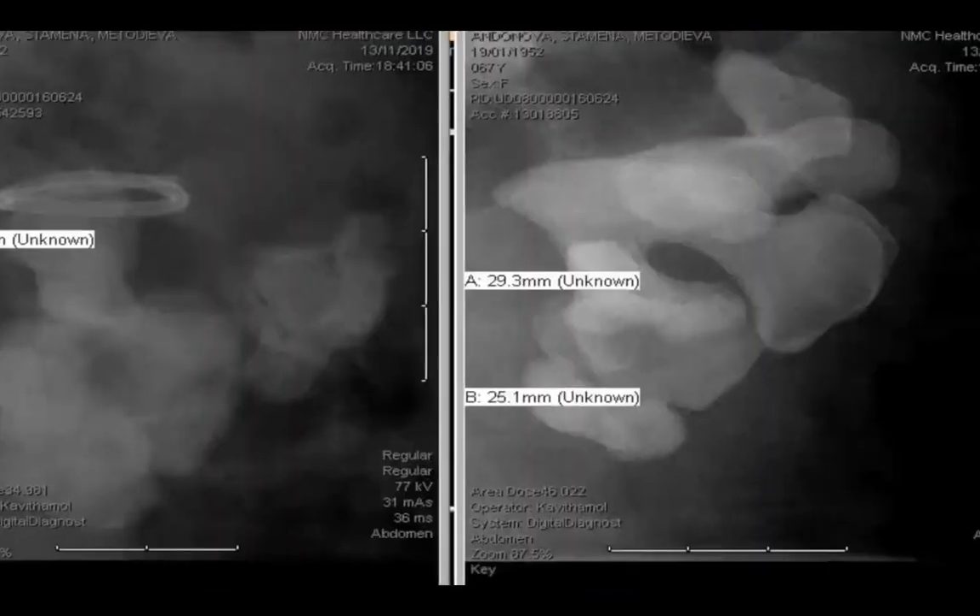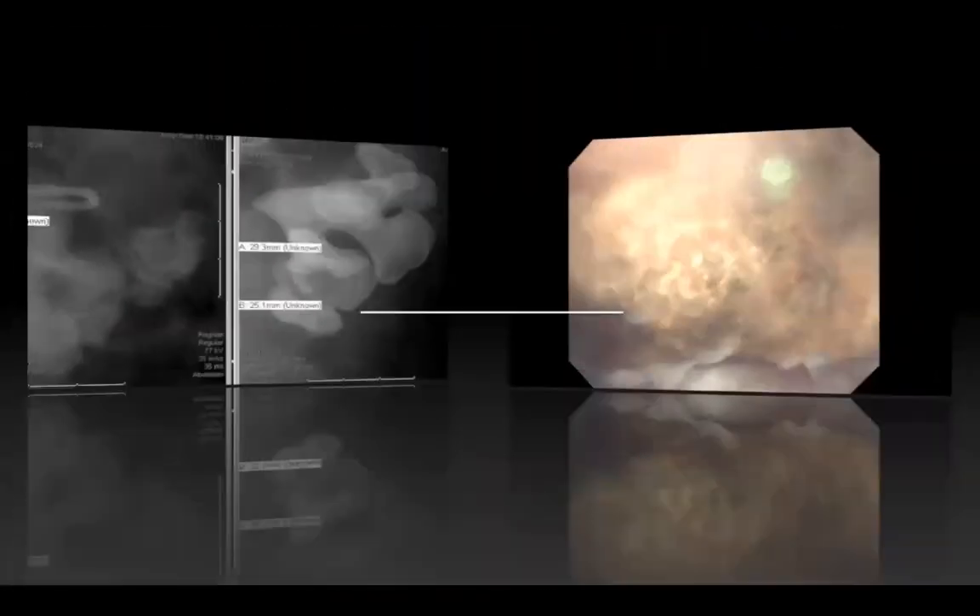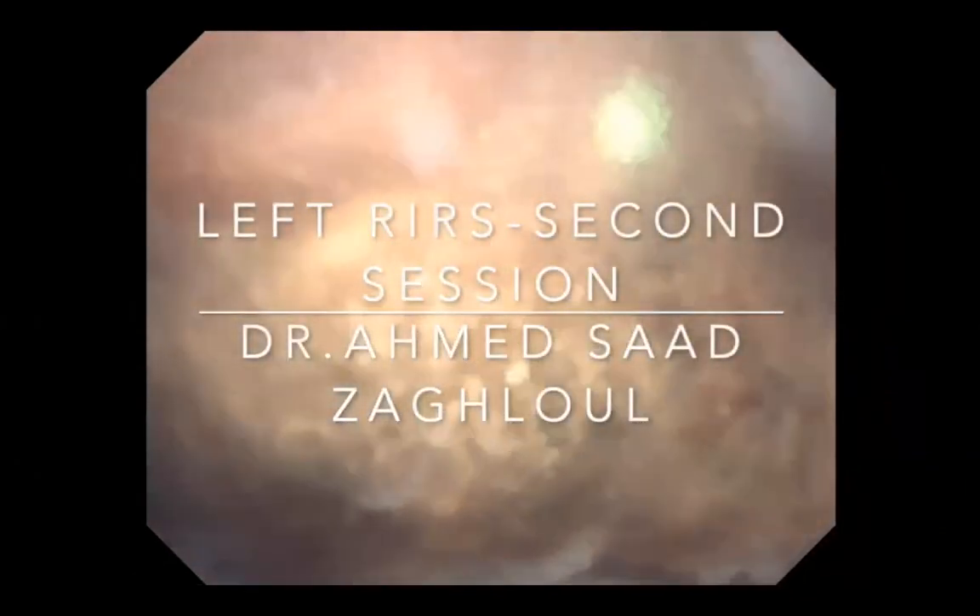After the first session, I removed almost half the stone and put a JJ stent. On the second session, one week later, I addressed the remainder of the stone on the left side, increasing the power and energy to 0.8 from the start. This part of the stone had a slightly high matrix content.